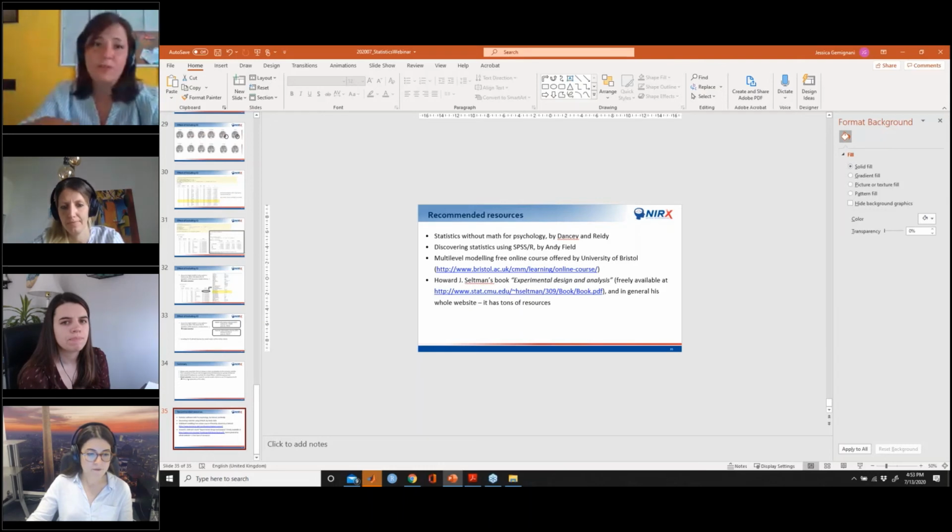I don't know which toolbox this user is using, but for example, in NIRS Lab, there is a function to add additional regressors, and even in the NIRS toolbox, you can define an additional predictor in the design matrix and put your covariate there.